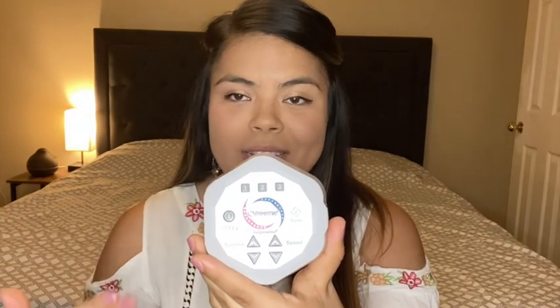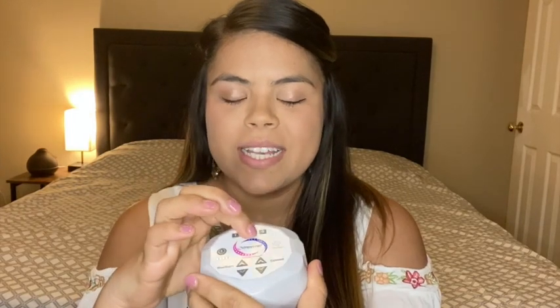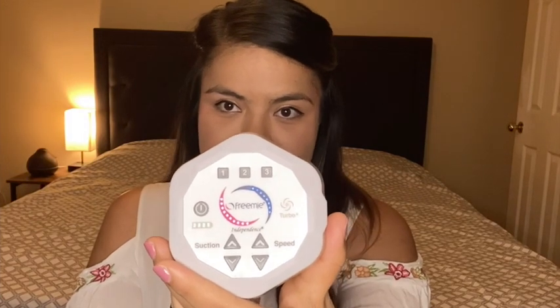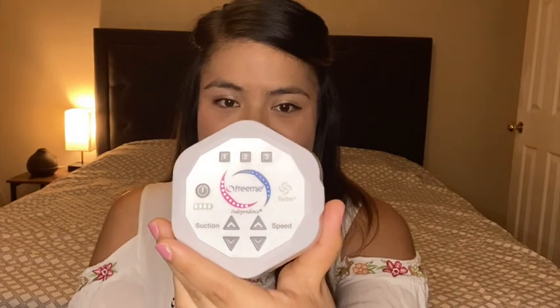Let me let you guys hear it. This is the first setting — hardly any noise at all. Then once I get the milk flowing I switch to the second setting, which literally just sounds like my phone vibrating. It's not loud at all compared to the Medela or even the Spectra. The Spectra is a lot less loud than the Medela but not as quiet as this one.